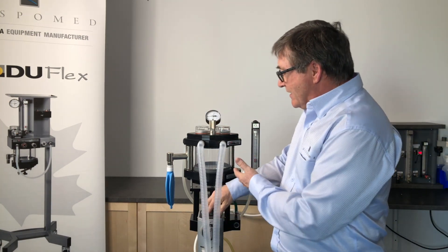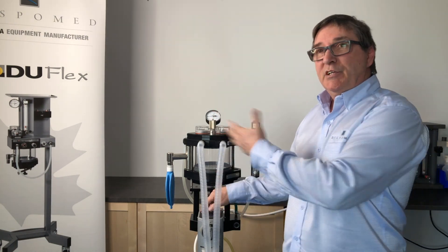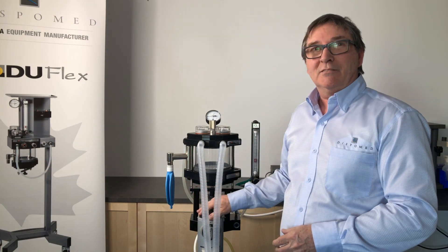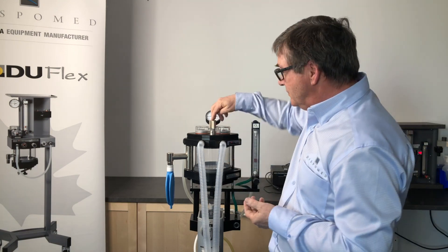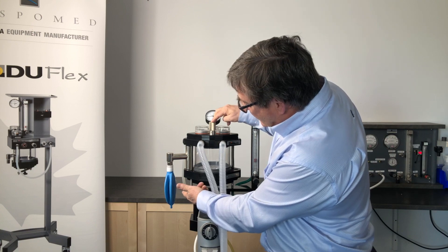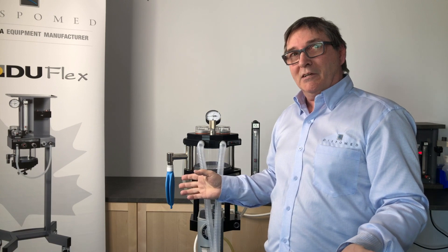I have my flow meter set at 500 milliliters per minute. My pop-off valve is open. This machine is completely gas-tight. How come my bag's not inflating? Am I ready to do the case? If I close my pop-off valve, watch my bag — it's inflating. And now it's completely deflating.